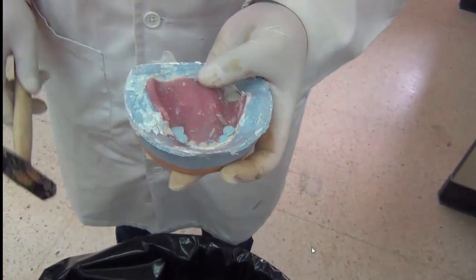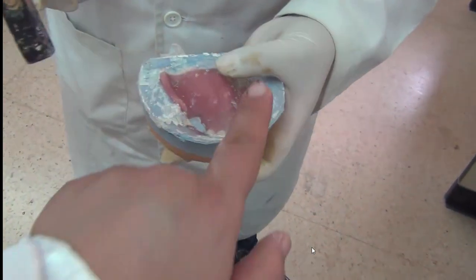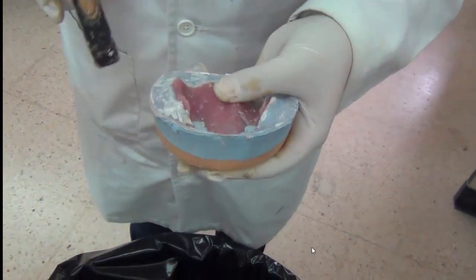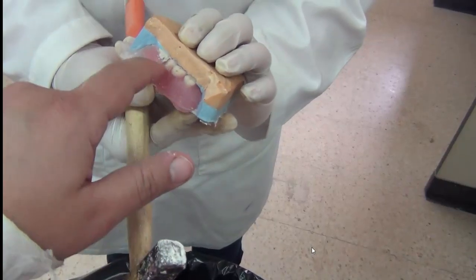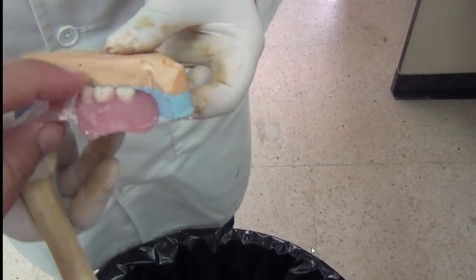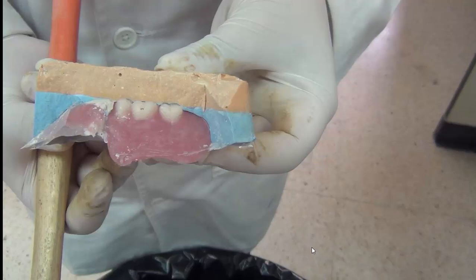We could also use another type of a plier or a cutter where we cut off the plaster, or use the knocking effect. Now, notice that she's holding the whole thing firmly in her hand. So the forces, when they come down, only come down on the edges, not on the center of the denture. Okay, notice that it's separated well. The separation was very easy because we had a separator between these layers. And it's very good here to see the opposition of the teeth with the stone, because it fractured at this line. So it's good to see how we have here the tooth opposed by the improved stone.